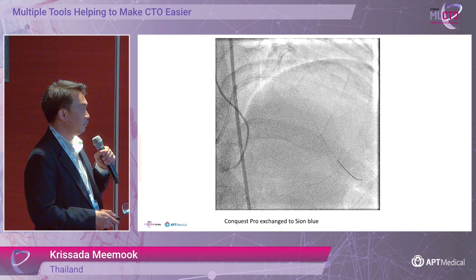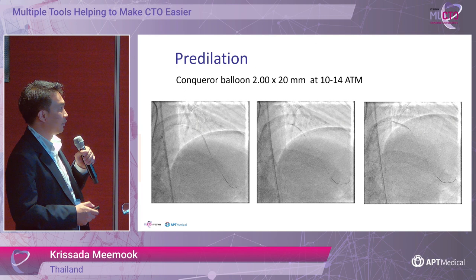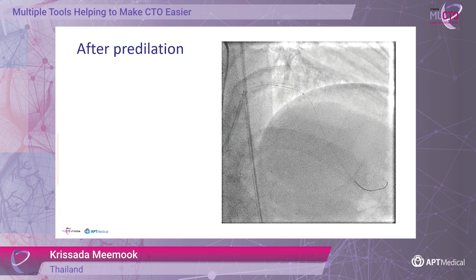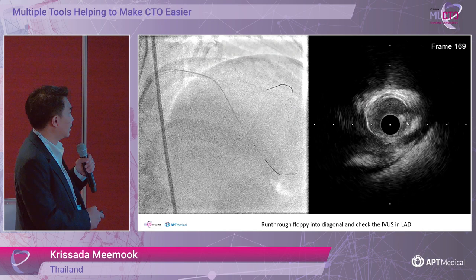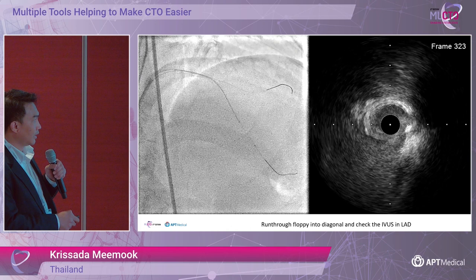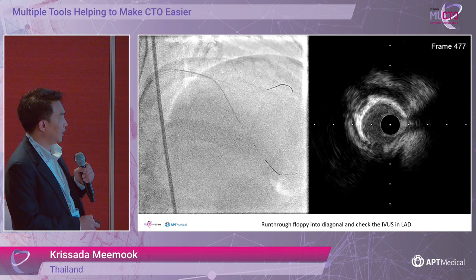Next, we performed balloon predilatation with a 2.0 mm balloon. This is the angiogram after predilatation — we saw some linear intraluminal filling defect in the mid-LAD that was not present before. I thought we might be in the subintimal space. So we put the wire into diagonal 2 and advanced IVUS into the LAD wire. You can see the LAD wire was in a false lumen, and when we pulled back the catheters, the wire was in a very large subintimal space.